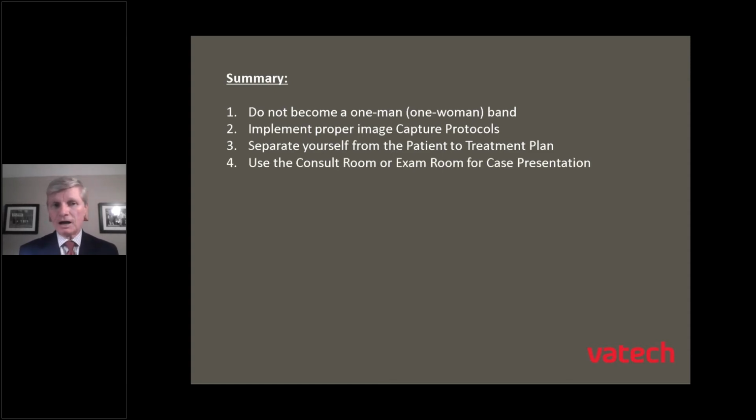And lastly, use the consult room or exam room for your case presentation. It's a great opportunity to empower or delegate either the treatment coordinator or the dental assistant in your office to help set that up, or help participate in the case presentation, or even bring up tutorial videos before you do your case presentation to the patient.